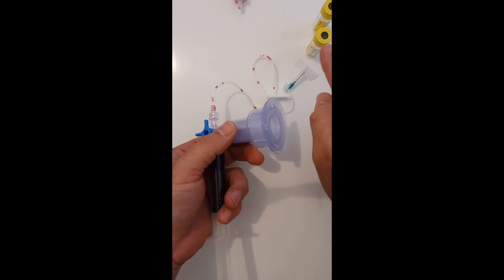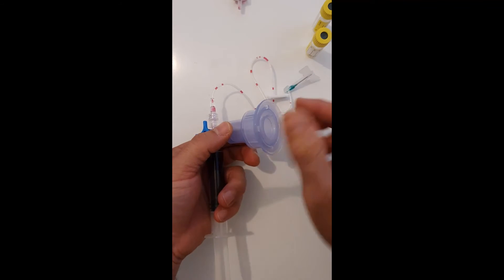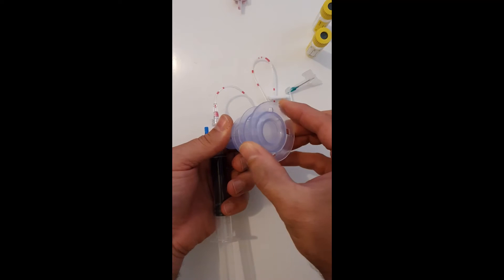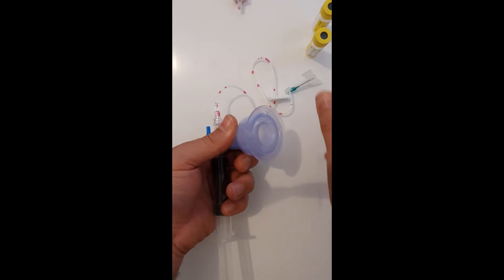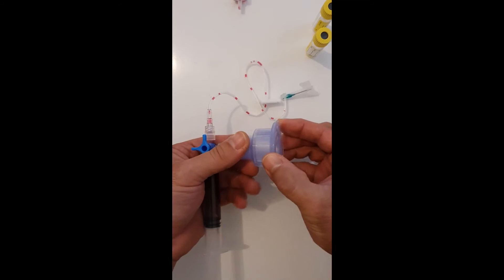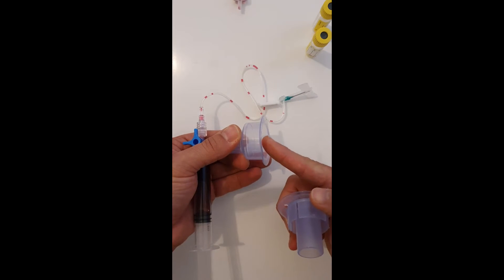If you're using the standard vial, you will just leave this end cap in place. Otherwise, if you're using the larger vacutainer, you can remove it and it will go straight inside.